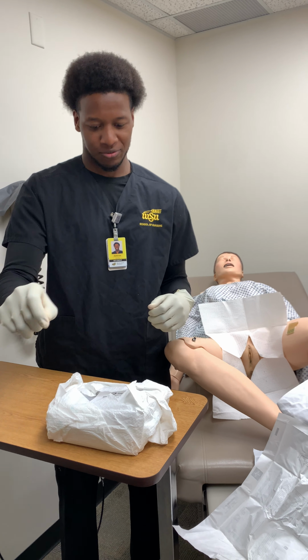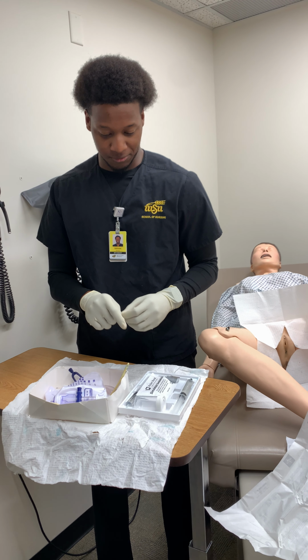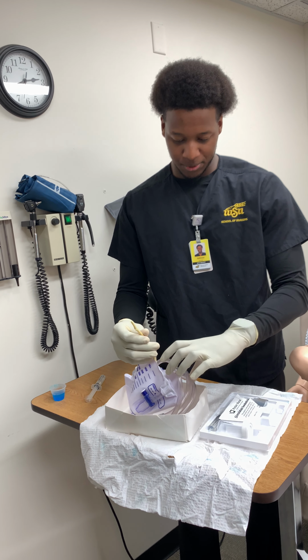And then from there, I'll make sure we have all the equipment that we need in here. Some equipment we'll need is the lube, the iodine, and the syringe to inflate the Foley catheter balloon to make sure the Foley stays in place. So first things first, I want to prep my lube here. After I put the lube there, I can discard it. No need for that anymore. And then make sure I get this prepared.